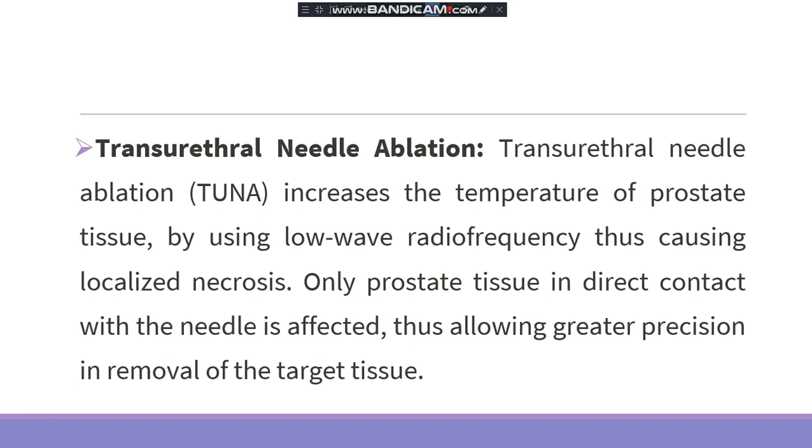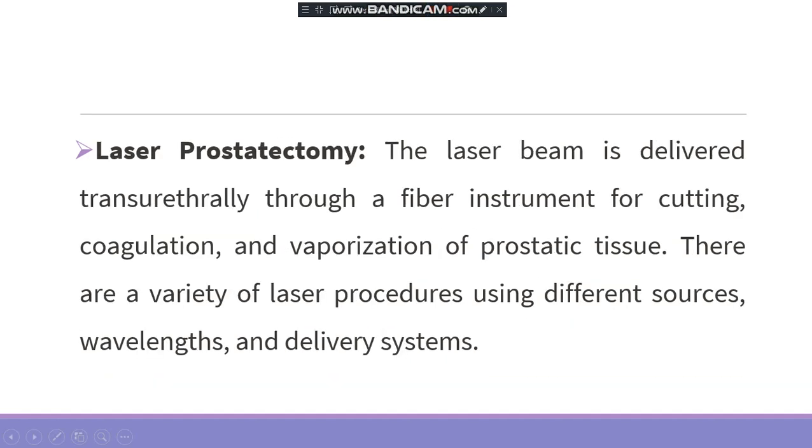Okay, so now we have another method, that is laser prostatectomy. Here, just removal of the prostate is being done, but the approach is different. From the name itself, we can understand the laser beam is delivered transurethrally through a fiber instrument for cutting, coagulation, and vaporization of prostatic tissue. There are a variety of laser procedures using different sources, wavelengths, and delivery systems.